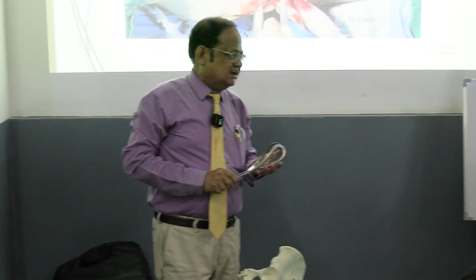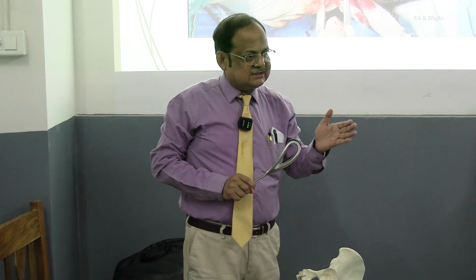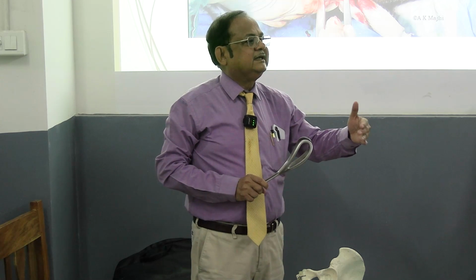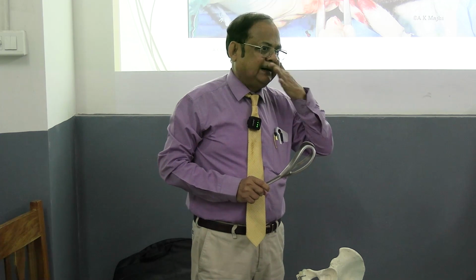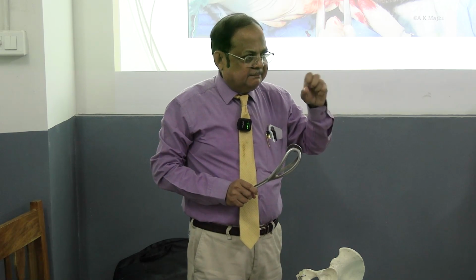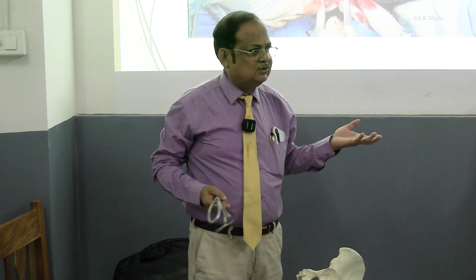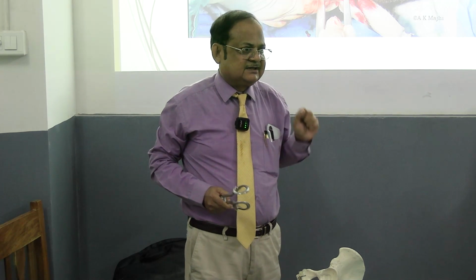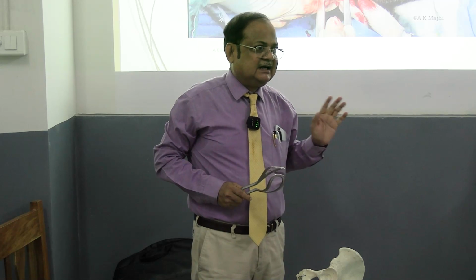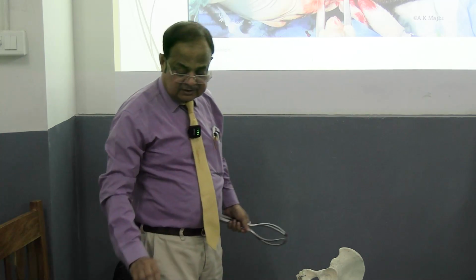Give the traction during the contraction, and also you can ask the mother to give her bearing down pain. The bearing down pain at this stage will be involuntary. Primary power is the uterine contraction, secondary power is the bearing down pain. That is the same as during defecation and urination, which increases the intra-abdominal pressure. And if required, you also give oxytocin if there is no fetal distress. So increase it during contraction, this is very important.